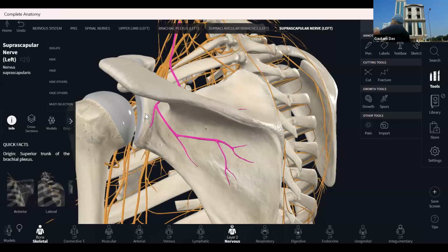My aspect marker is towards the lateral side, and I'm palpating the spine of the scapula. I'm putting the probe here. When I put the probe here, what can you see, the short muscles? I'm just a little above. I was here only.